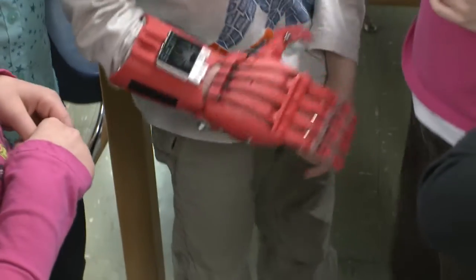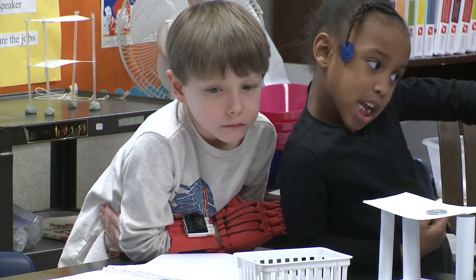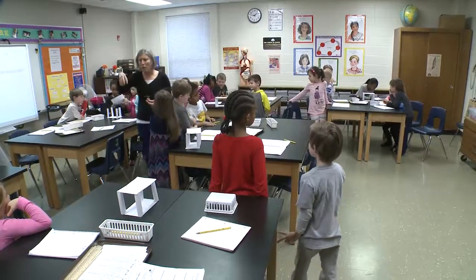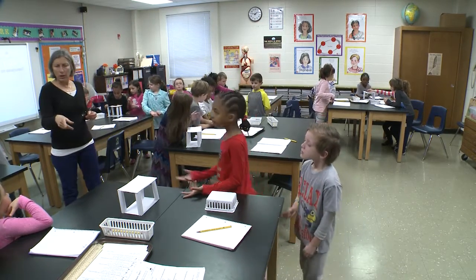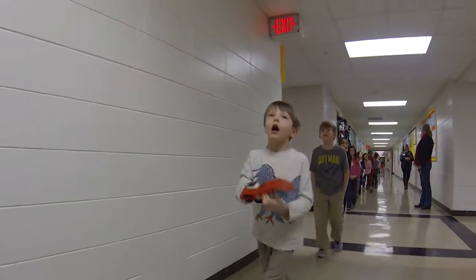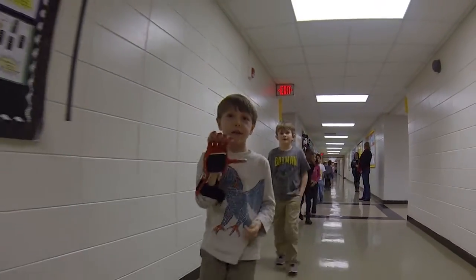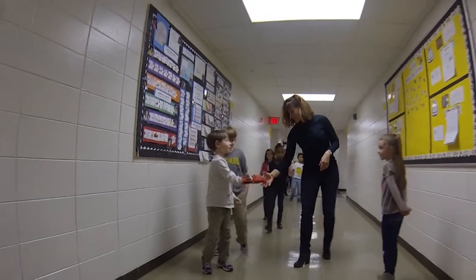He's never, ever said he can't do something. He'll always just say, 'Can you help me?' We now have an occupational therapist that Lucas sees. There was concern with his growth and development on that side of his body, and the strength that he's starting to build — the muscles he never used before. It's pretty big stuff as far as how it's going to be for him growing up. This is the time that his body is growing, and it couldn't have happened at a better time.